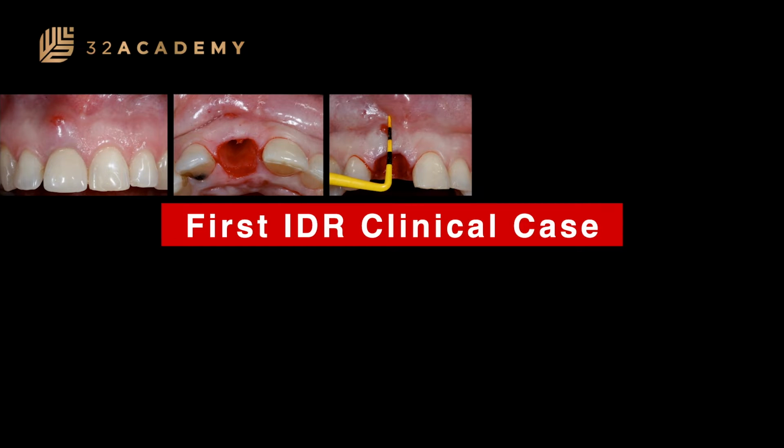This was our first IDR clinical case. As you can see in the upper right central incisor, we have the presence of infection, total loss of the buccal bone wall, and a fracture.